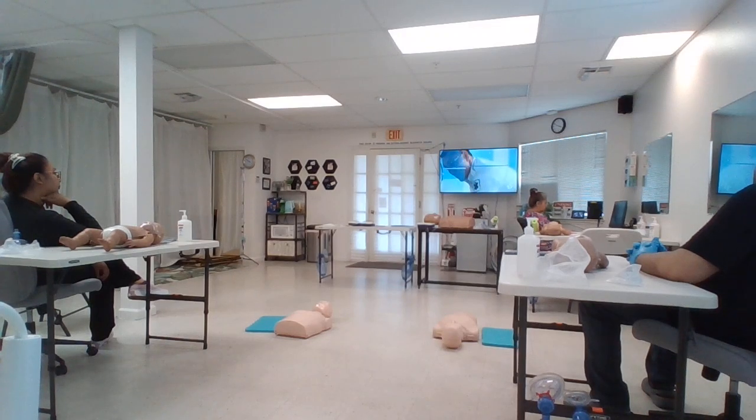The next category is what to communicate. Knowledge sharing and summarizing information are critical components of effective team performance. Team leaders should review what's happened, ask for ideas and observations from team members. That's our second shock. We have 1 milligram of epinephrine on board. Okay, starting another 2 minutes. Okay, 100 milligrams of lidocaine.